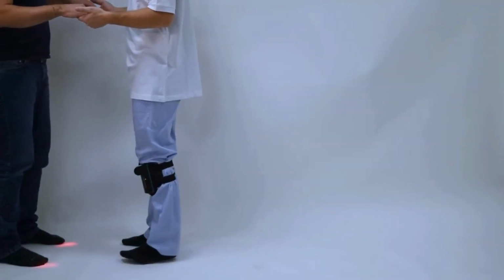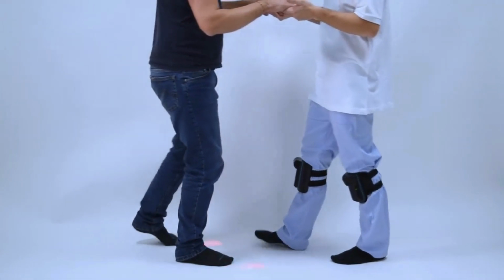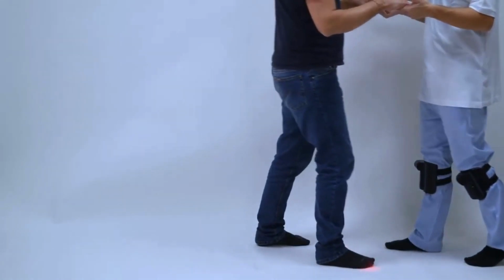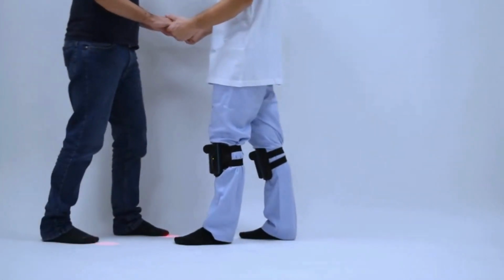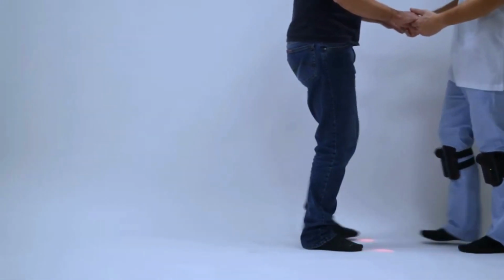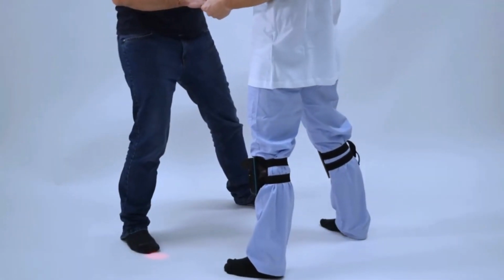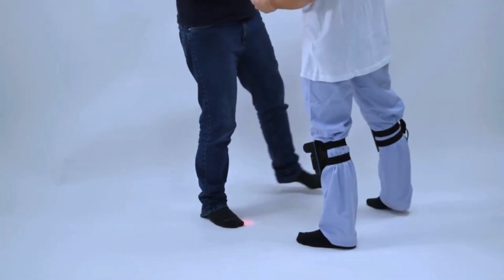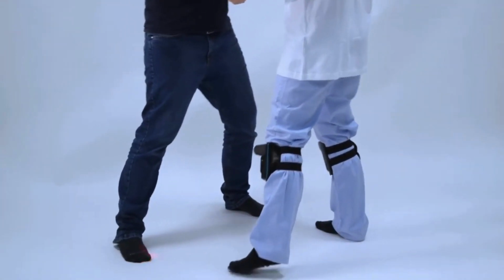Reaching out to physiotherapist. It is also possible to use cue walk worn by the physiotherapist to perform exercises in training guided and controlled by the physiotherapist himself. The patient is required to reach the targets generated by the physiotherapist's movements. In this way, the physiotherapist can have more control and guidance over the patient's movements. Very useful exercise in the early stages of training or when the degree of impairment is high.